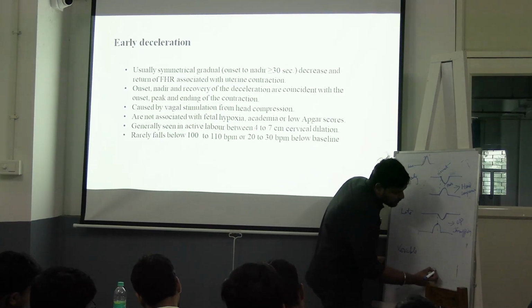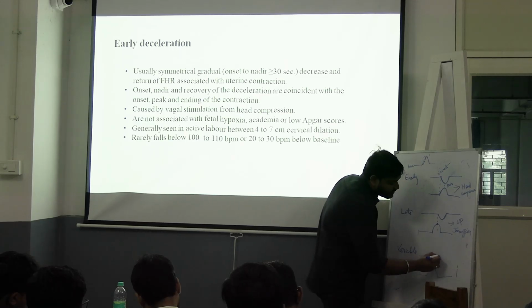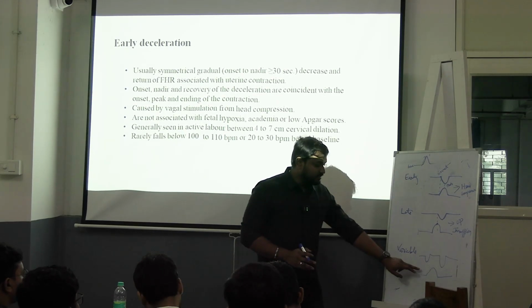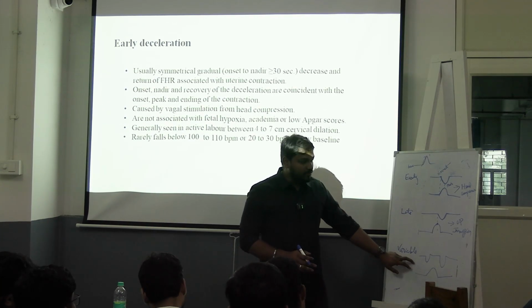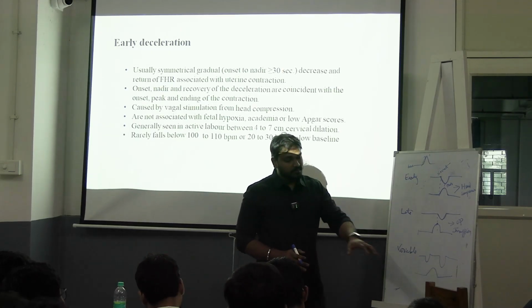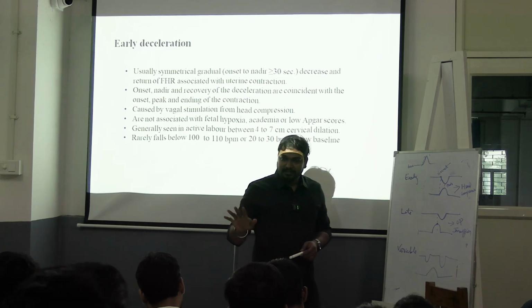Variable, there is contraction. Okay, but fetal heart rate, it doesn't depend on the contraction at all. It doesn't depend on the contraction. Anytime it will occur. That is variable. You see variable deceleration in cord compression. Okay sir? Understood?